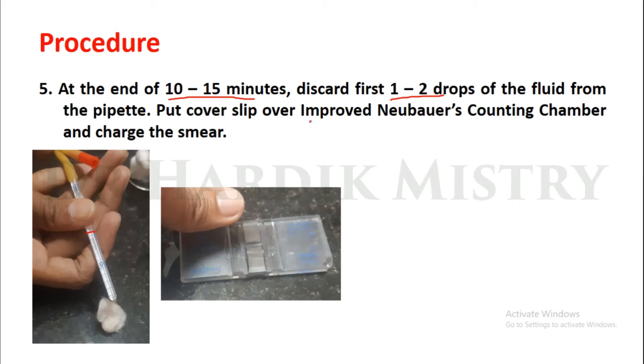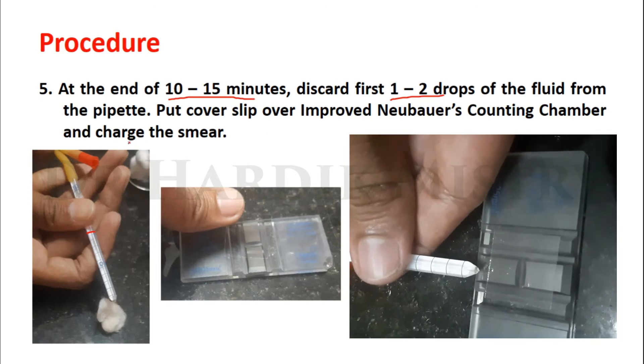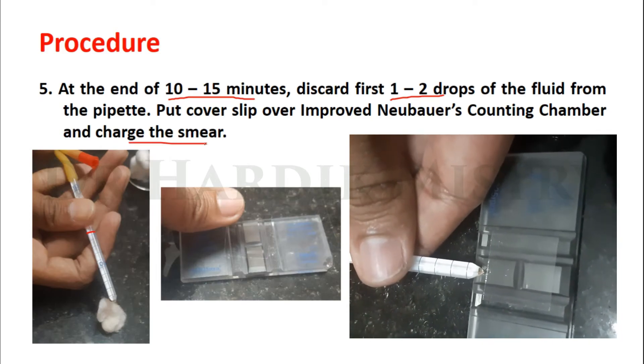Put a coverslip over the improved Neubauer counting chamber and charge the smear as you are seeing in this video.